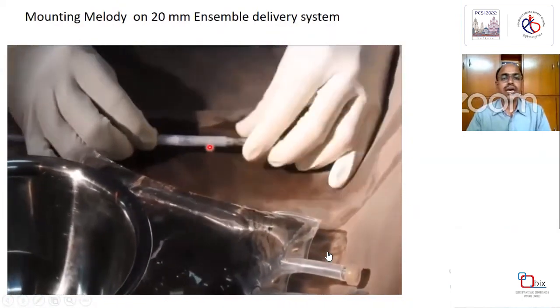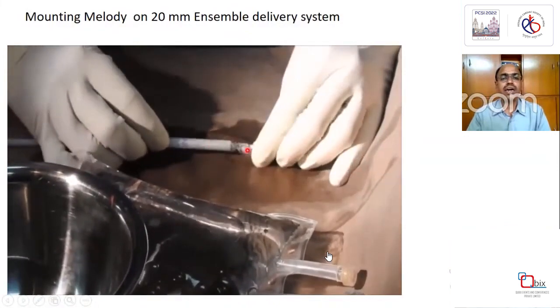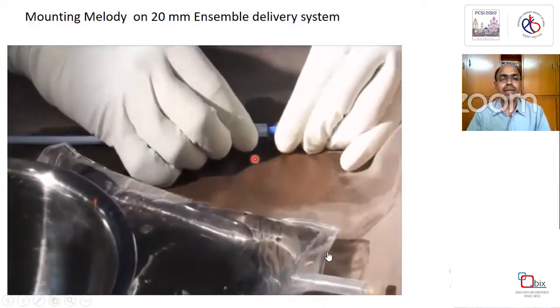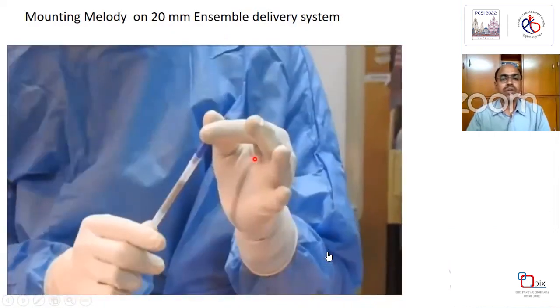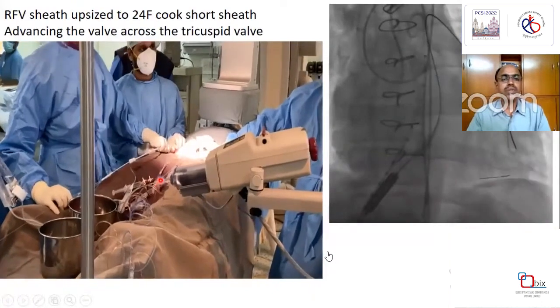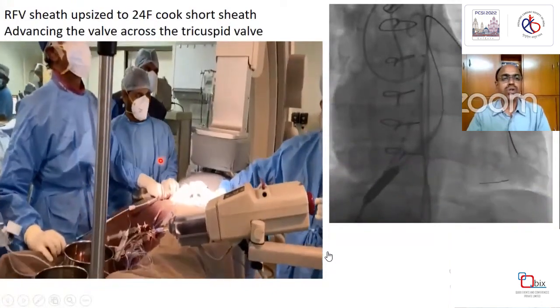So the nylon sleeve has fully covered the Andra stent and the Melody valve. We do the final de-airing, and now the valve is ready for deployment. We take it through the groin sheath, which has been upsized to 24 French.